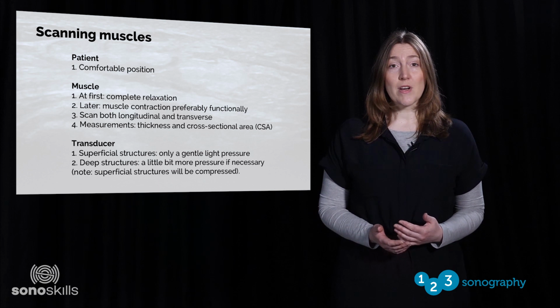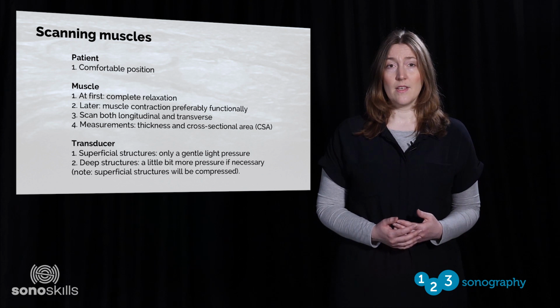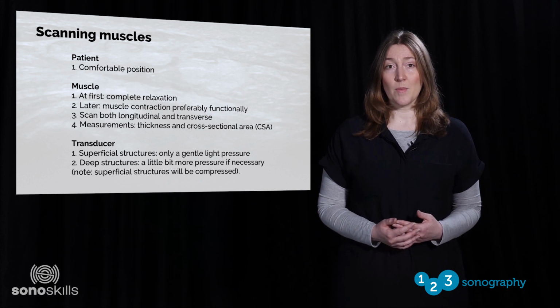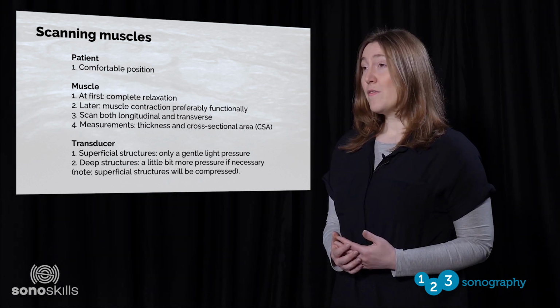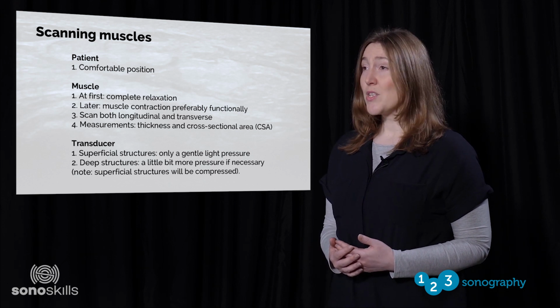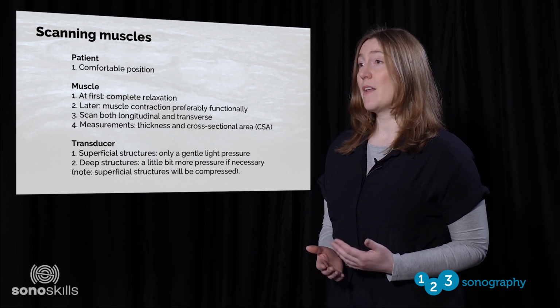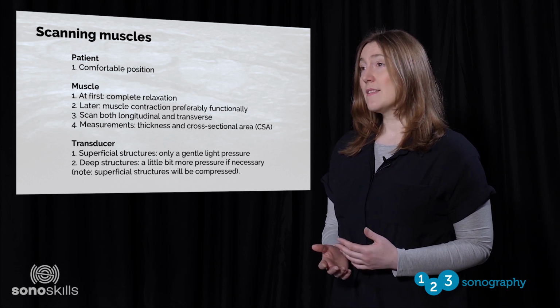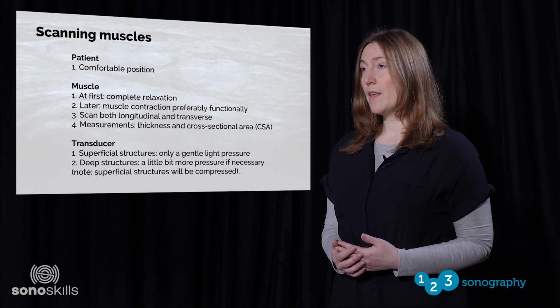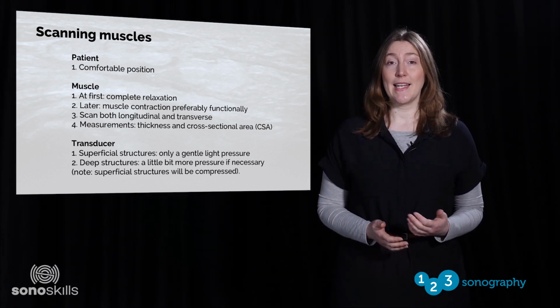Please bear in mind that the hard pressure of a transducer leads to the compression of superficial anatomical structures. This leads to false interpretation of findings, as you have not scanned the muscle in anatomical dimensions. Therefore, it's important to scan with a very gentle transducer pressure to avoid this. Compression is to be avoided. Sometimes you'll have to add more compression if you are to scan very deep structures. In that case, the compressed superficial anatomical structures are acceptable. Focus will only be on the deeper structures. With compression, you can sometimes see a little better in depth.